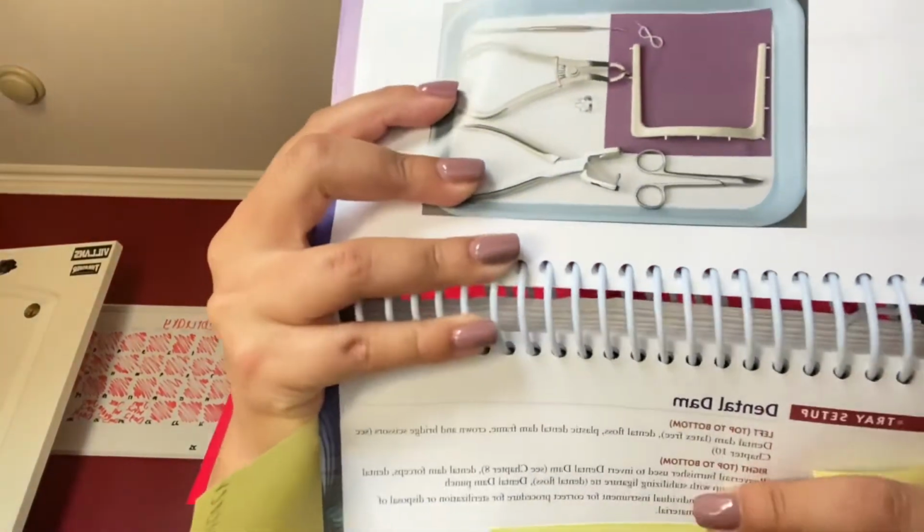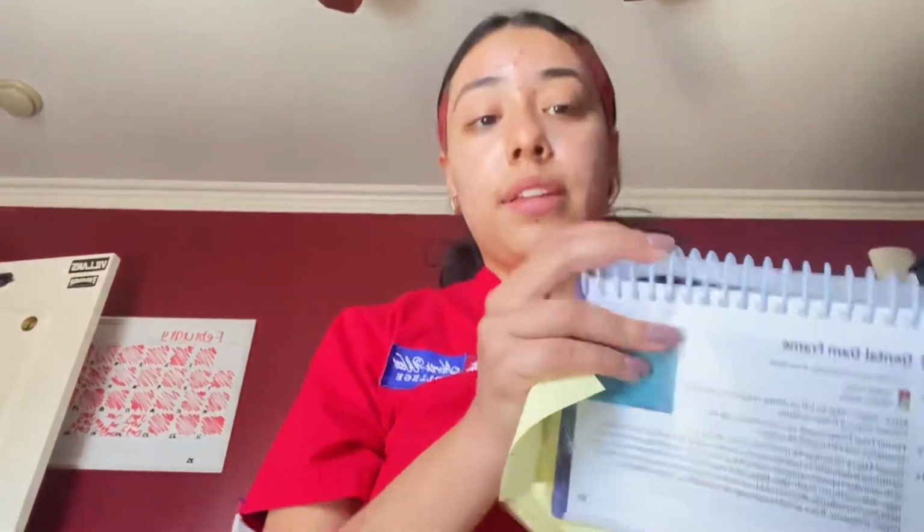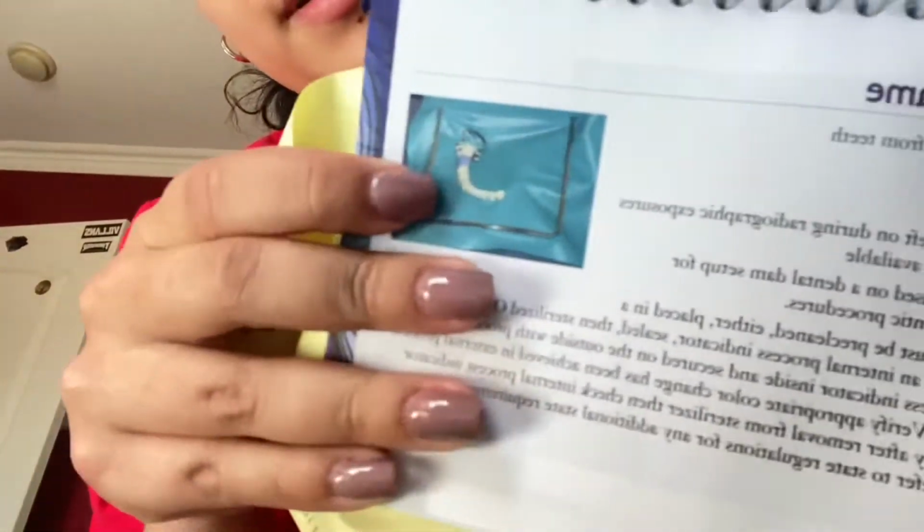And then once the patient can feel the anesthetic, we're going to go ahead and place the rubber dam to isolate the tooth that we're going to be working on, which looks like this. It comes with the dental dam, the clamp, the frame, and then the scissors. So when we put it on the patient, this is what it should look like. Right here, down here.